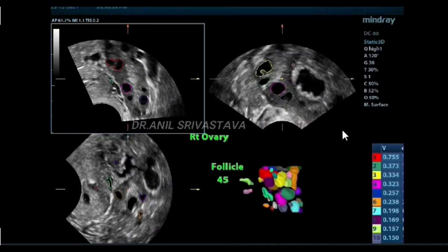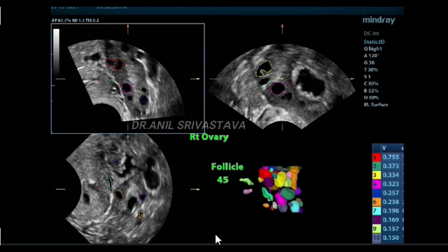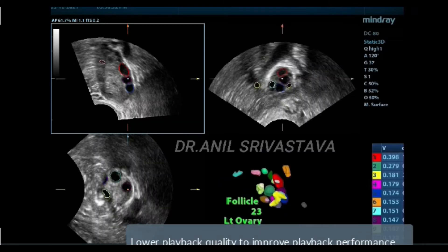You have to take the average of the two. This is the right ovary having 45 follicles in it, and this is the left ovary having 23 follicles.